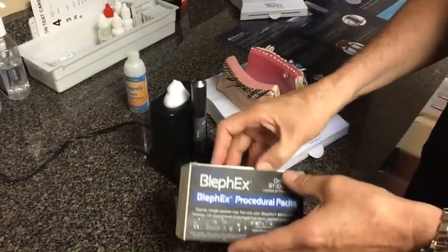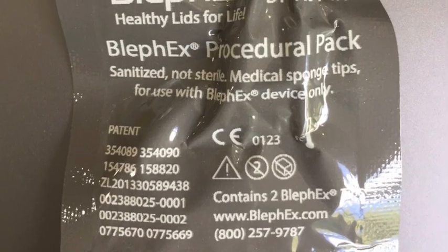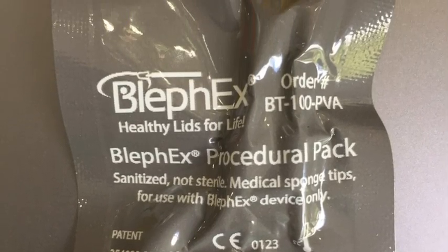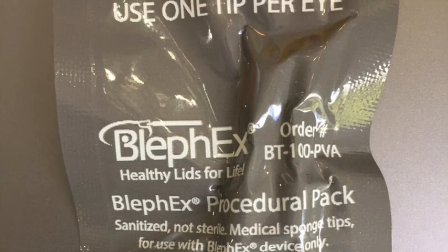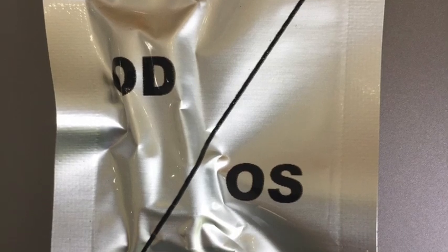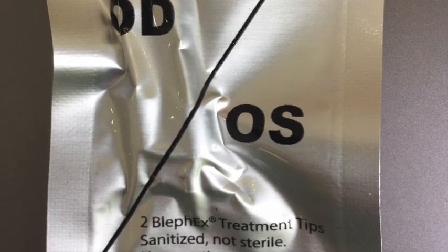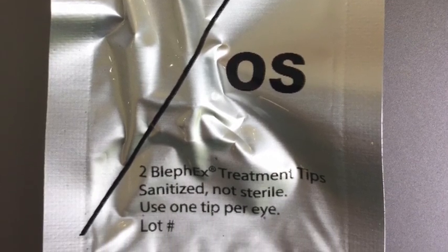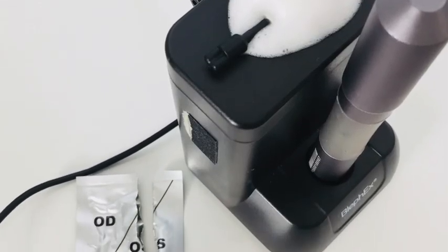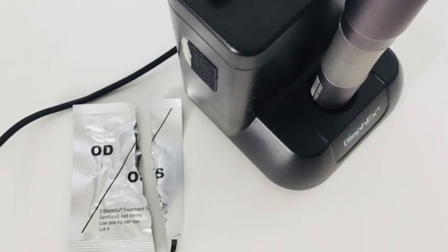Then we're going to open up our box of tips. Now, our new improved treatment protocols allow for 1 tip to be used per eye instead of the old 1 tip per lid. So you'll notice now that the tip packs only contain 2 tips, 1 for each eye to be used. So you open up that tip pack, you take those tips out, and you lay them in the foam on the back of your charging base, and you let those soak.